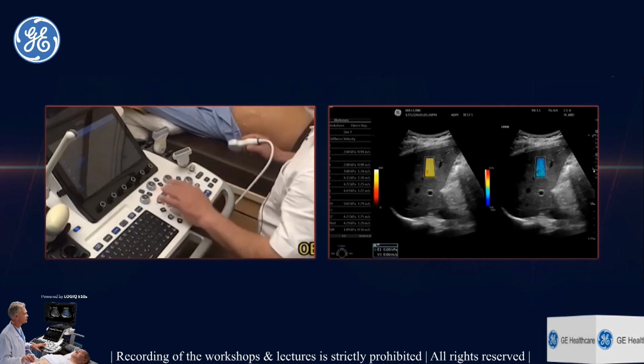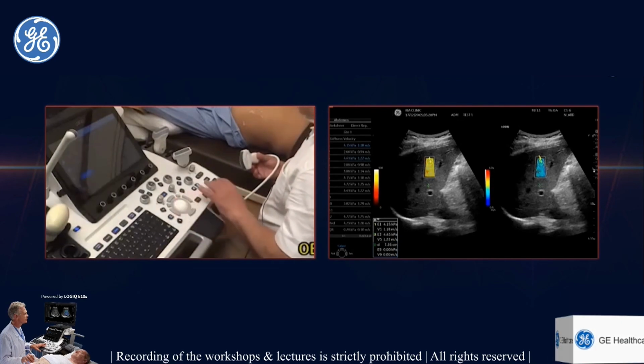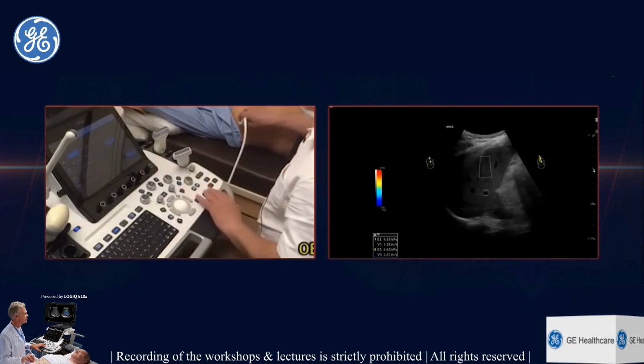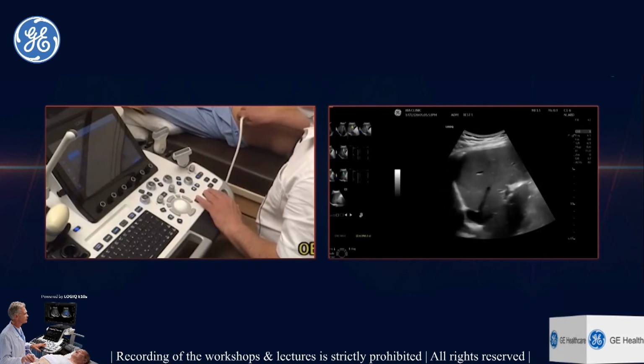That's again a good map here. And we look at the final, it is about 16.4% and 8.2%. So this seems like a reasonably good result. It's 1.2 meters per second, which is normal. Now let's look at some other advances.